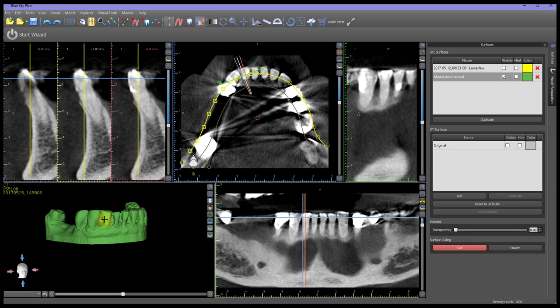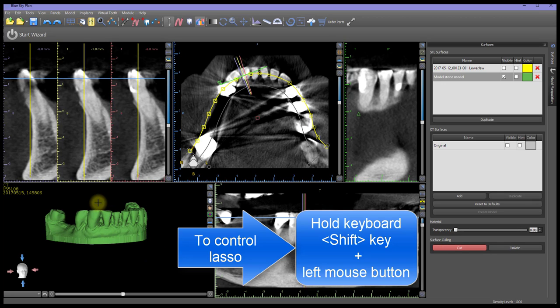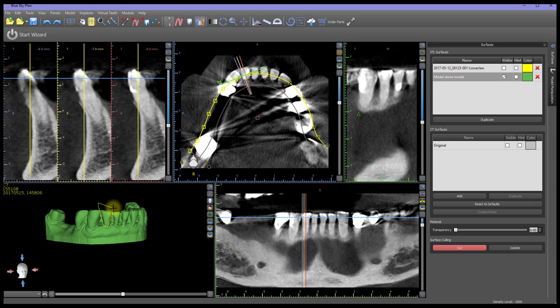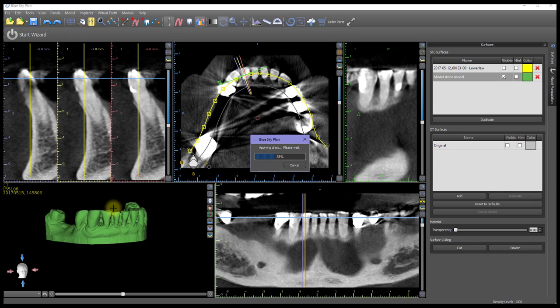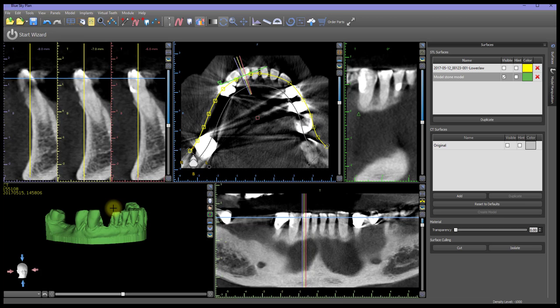Move the cursor to the 3D view, hold the keyboard Shift key and the left mouse button, and drag the lasso around the tooth outline. Release the left mouse button to execute the cut function. This may be repeated as necessary for trimming or performing additional cuts.